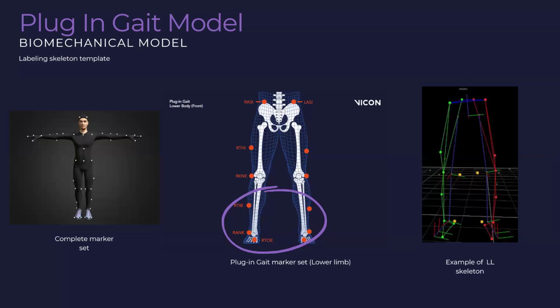Honestly, I don't know. Maybe, but the thing is the COP trajectory is a little bit like that. I need this information, but at the same time, if I'm trying to assist during the stance phase, I think it's more the progression of the center of pressure during the stance phase that I need to assist. But that's a good remark.